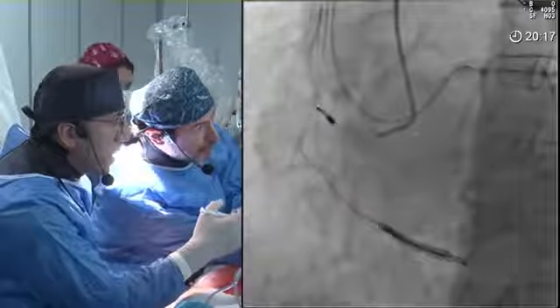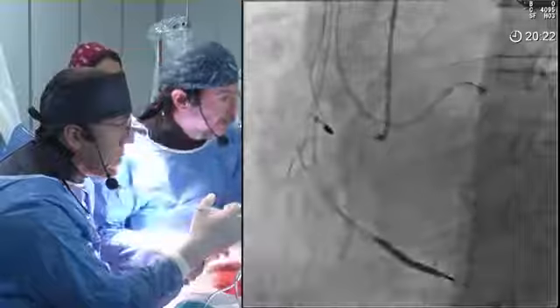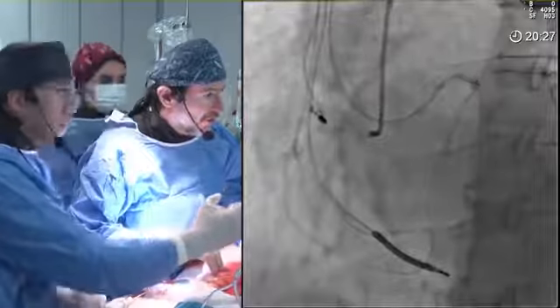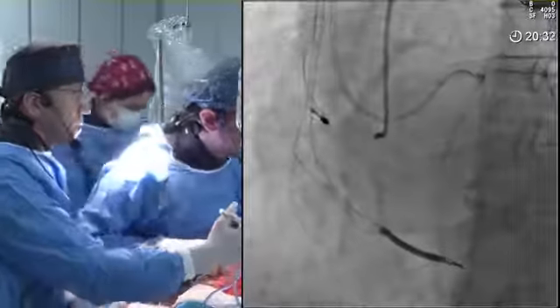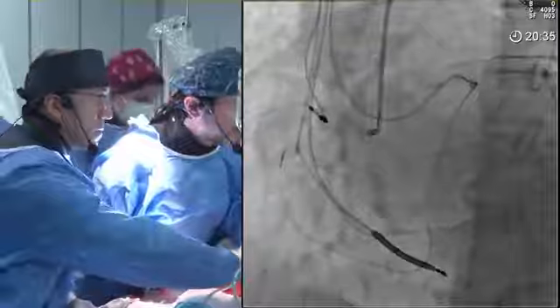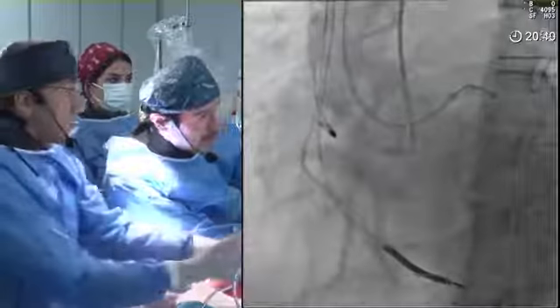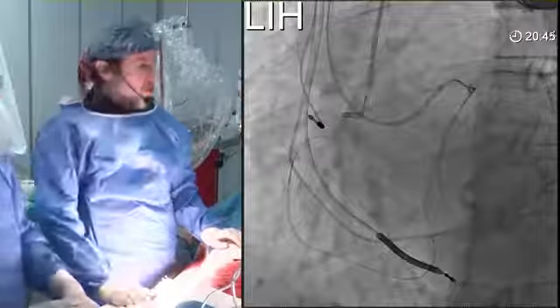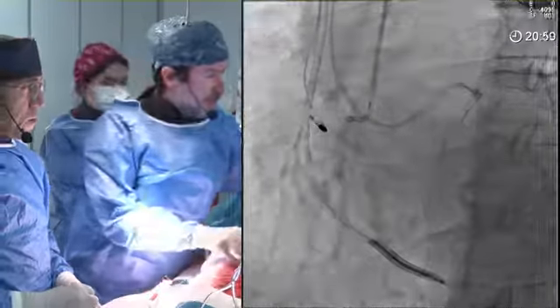Dr. Firuz? Yes, I think in this patient we have some kind of calcification in the upper part of the right coronary. At least CT can say whether it's aligned with the RCA or not, and we can also assess the distance with CT. On the other hand, I do agree with keeping the retrograde microcatheter at this distance, because we should find the loosest part of the proximal cap for puncturing, and maybe it can help us be safer.